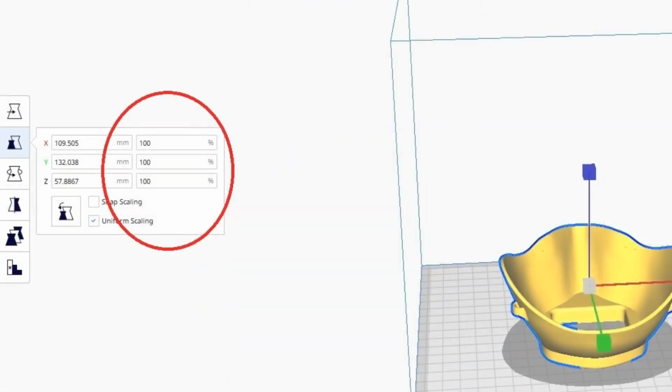It works just fine. You can also adjust the scale to make them larger or smaller. 90% seems to be good for smaller faces. Just don't forget to also scale those inserts.